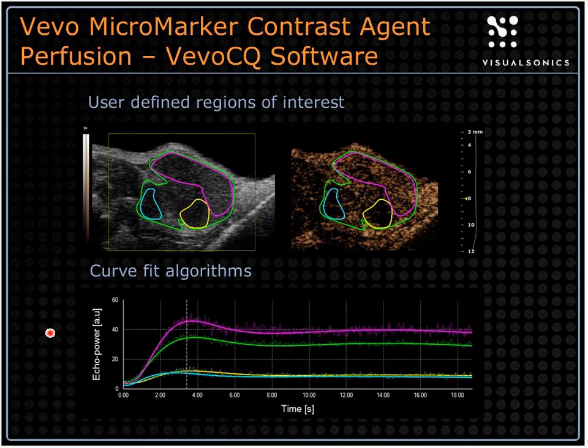That's great, Stephen. I hope that's helpful for a lot of people to understand how that bolus model is actually working and giving enough time to let it really do its job.